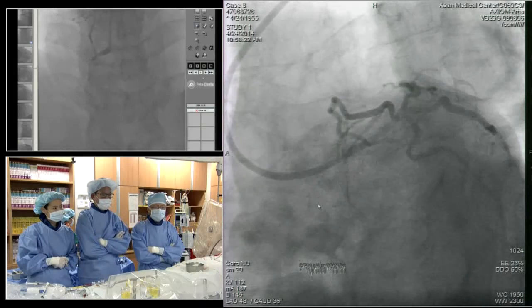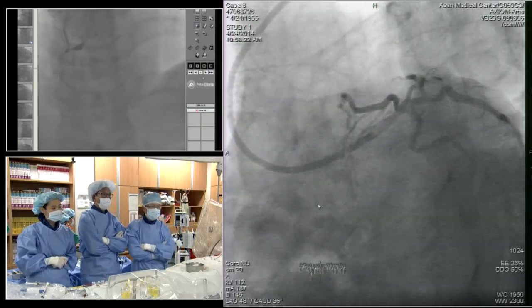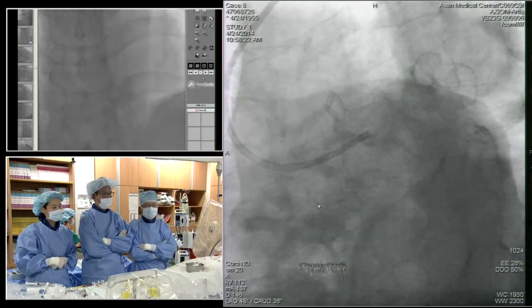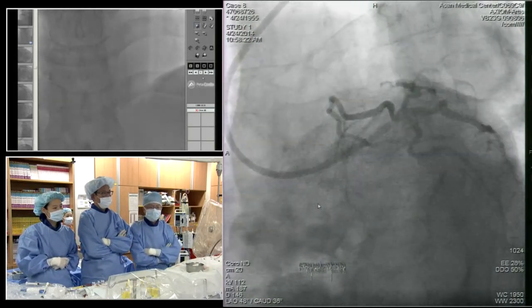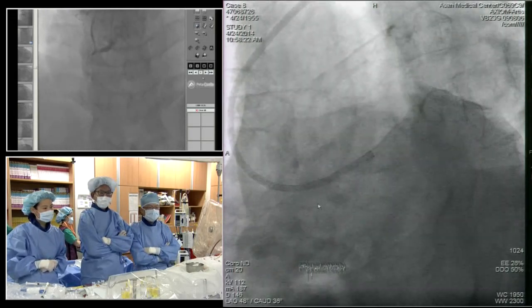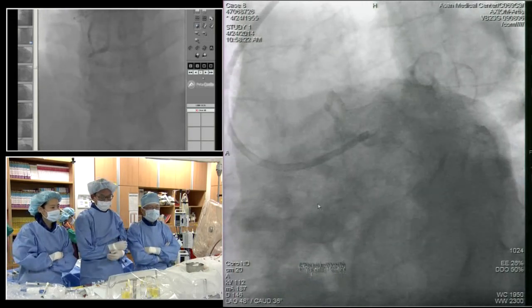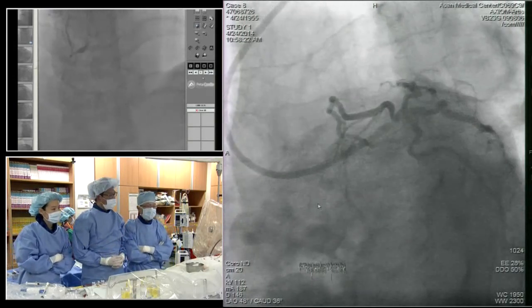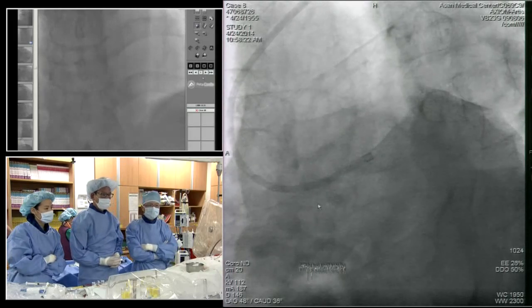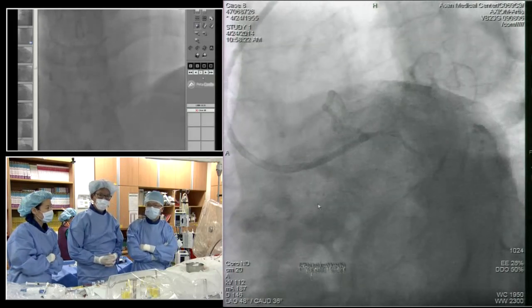Okay, so I think if we look at the history, it's actually quite interesting that he's completely asymptomatic, undergoing an executive checkup. So if you look at the U.S. Appropriate use criteria, he is relatively high risk: male, 60 already almost, ex-smoker, diabetic, a family history, hypercholesterolemia. So the pre-test probability is relatively high.